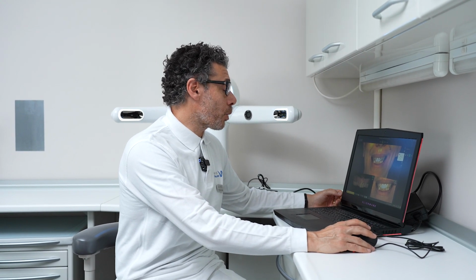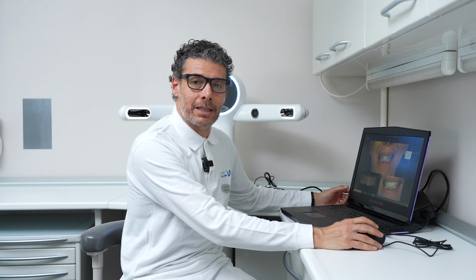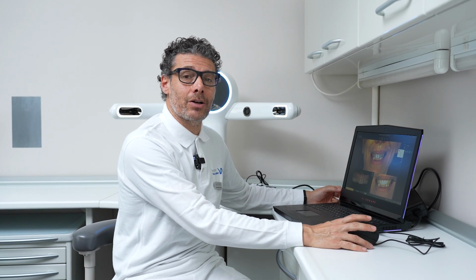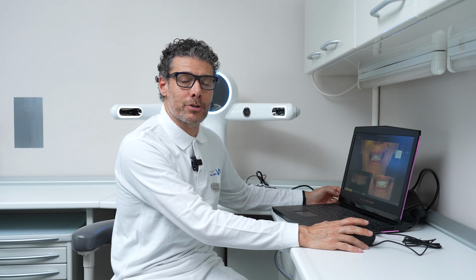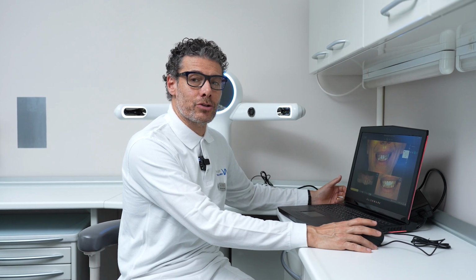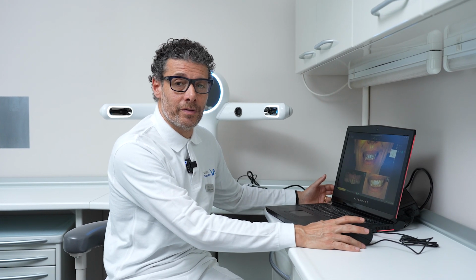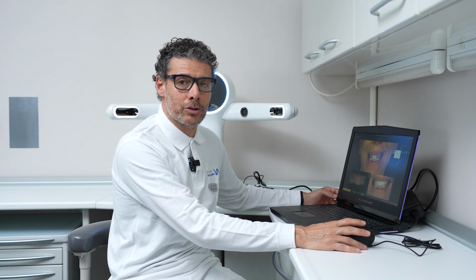On the other hand, with regard to clinical cases with implant involvement, the alignment is done with the intraoral scan of the scan abutment, so you will have to maintain the scan abutment in the patient's mouth and take the facial scan and smile with the scan abutments. Afterwards, all these scans will be aligned within the dental system CAD/CAM software by our technician.